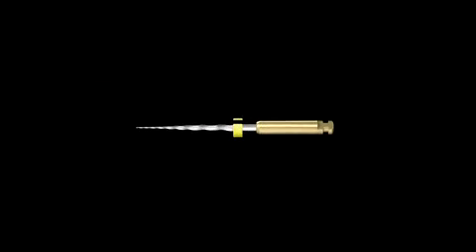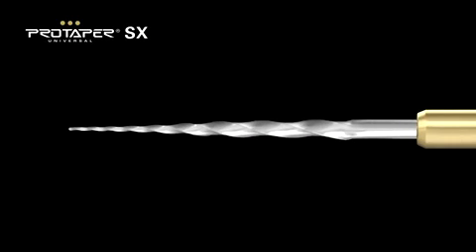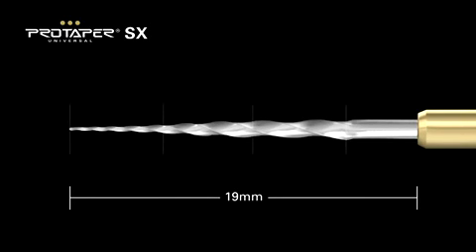Let's look at SX to appreciate a little bit more. Shaper X, or the auxiliary file, is 19 millimeters in its overall length. If you divide the file into thirds, you will notice that the middle one-third of the file is actually the part of the file that's designed to cut. The apical one-third of this instrument is not designed to engage and do heavy work. Simply, it is the steering wheel on the nickel titanium file that guides the instrument through curvatures. So we don't want to cut in the apical one-third.